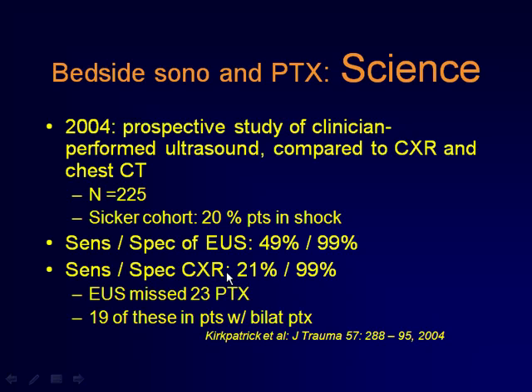This test gives far fewer false positives than false negatives, and it was compared to chest X-ray with a composite endpoint including CT, and it was about twice as sensitive as chest X-ray.